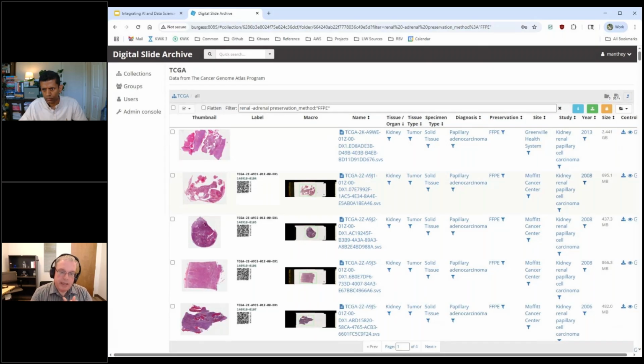And if you had a collection that you're happy with, you could say, this is the data I want to work on. I could select to copy it and then copy it, and this would just copy my list of images to a folder specifically for a project. It doesn't actually duplicate the image data. It's just making references so you know what's in there. That's often a typical way to start a project: you take your existing data and say, let me see what I have. Do I need more data? Do I have enough to answer these questions? Let me do my exploration of the data I even own so I can actually do the process I'm working on.